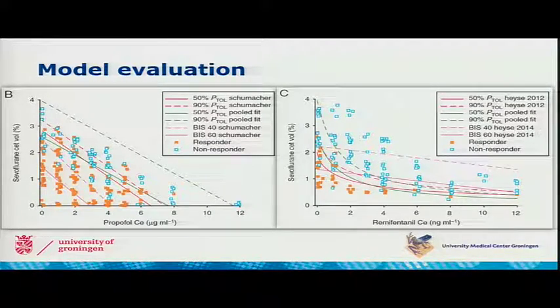In panel C, what stands out is that at low opioid doses, the PTOL 90 moves far above BIS of 40 again, same as here. So only at a concentration of remifentanil of lower than 1.5 nanograms per milliliter, you need a BIS of at least 40 to ensure a good probability of tolerance of laryngoscopy.